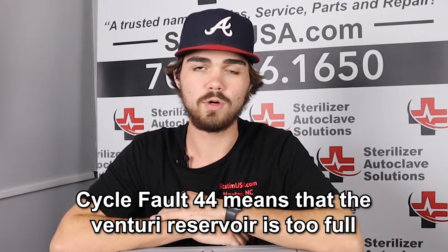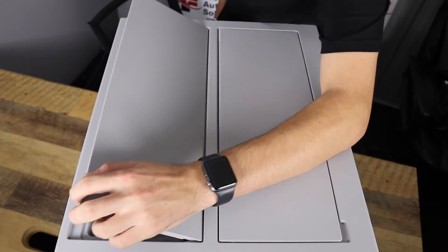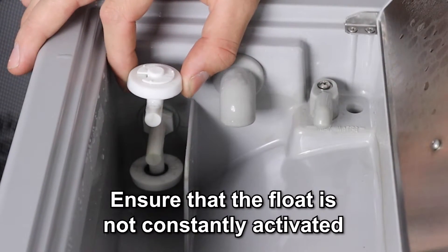With Cyclefault 44, it's typically indicating that your Venturi Reservoir is too full. What we'd like to do is open up your Venturi Reservoir and take a look inside, make sure that this float is not constantly activated. If that float is constantly activated, that's going to be the cause of your Cyclefault 44.